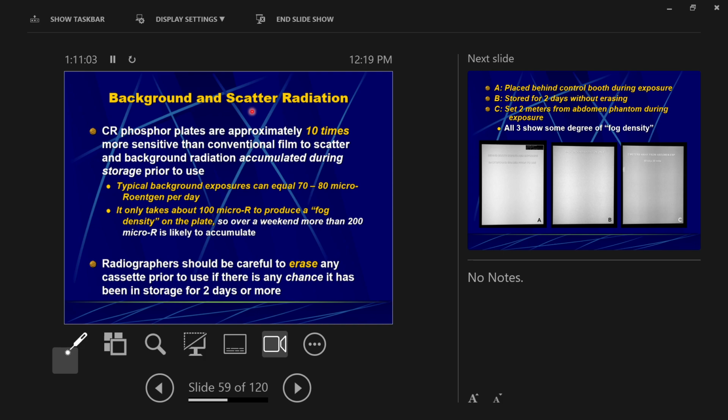Can you accurately predict exactly where the water is going to scatter? No, not really. You can kind of have an idea though, right? If I point it directly at the wall, I'm going to get more scattering. You ever do the dishes and get sprayed in the face, right? Like spoons and bowls and stuff. You spray the water and it loops around the bowl and sprays you right back in the face, right? So you're kind of smart about it. You tilt the bowl away from you when you spray it, so it sprays at your backsplash, right? So you can get an idea of where water is going to scatter. You can also get an idea of where radiation is going to scatter as well. Okay, you can't predict it exactly, but you know sort of where it's going to go, kind of like where you know the water is going to spray when you're doing your dishes.